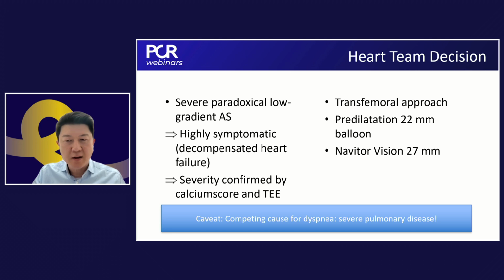In this situation, the leaflets are intra-annular, but due to the leaflet configuration we have a very good opening, so hemodynamics is still good. Due to the large stent struts we have relatively easy coronary access, and I think it is also a little bit easier to do redo TAVI having an intra-annular valve design.